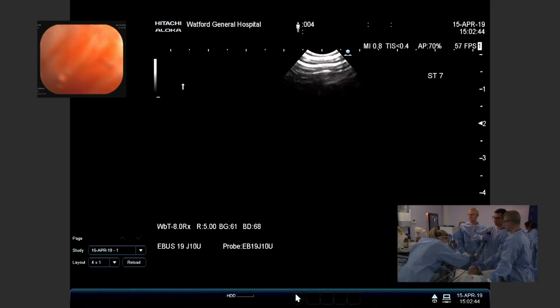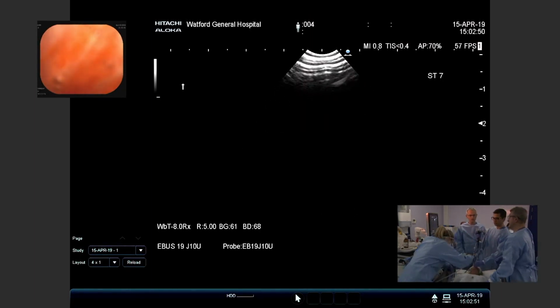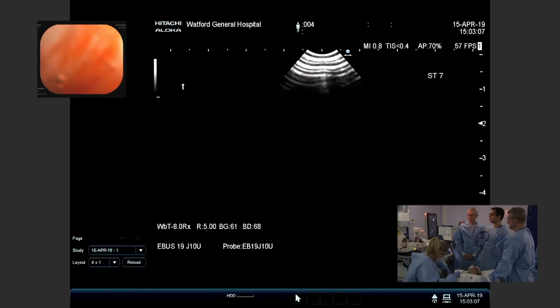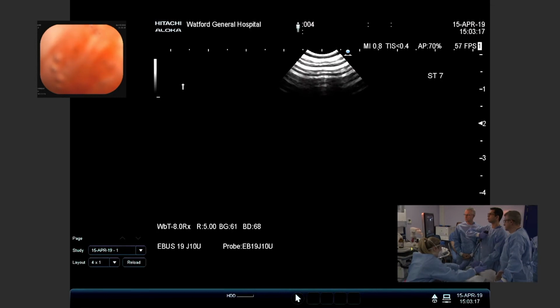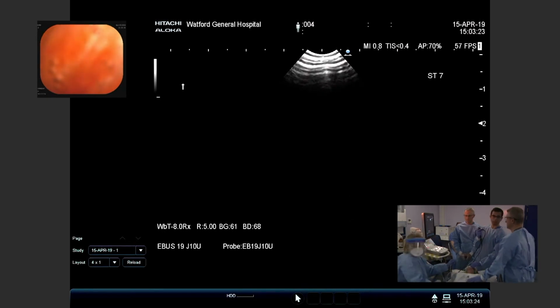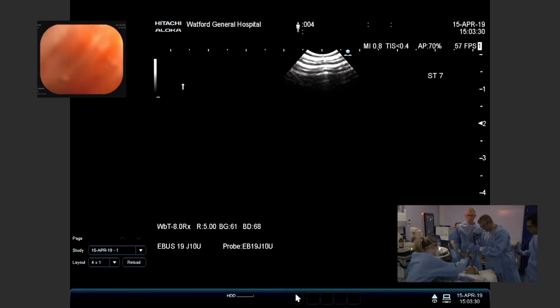We might have to call it today. Is there ever a leeway to remove the scope to clean the lens, or would you never do that? So re-intubation is always very tricky, difficult, especially with her. They're coming up again now, so 93. It's really difficult. Do you want to try to see whether you can clear it up? Yeah, I'll go. You can do it. It's got oxygen.